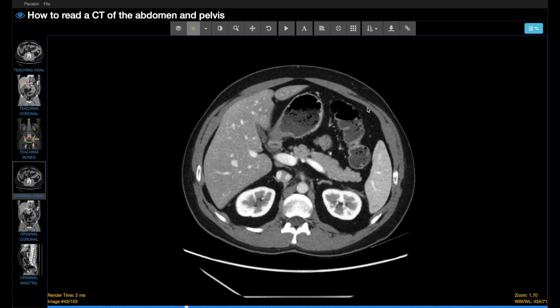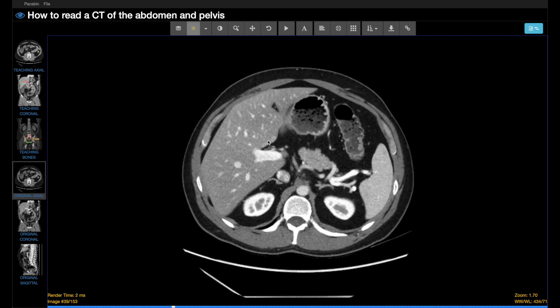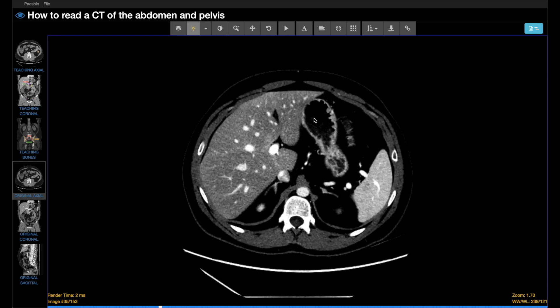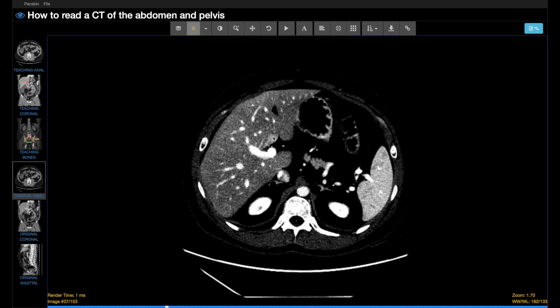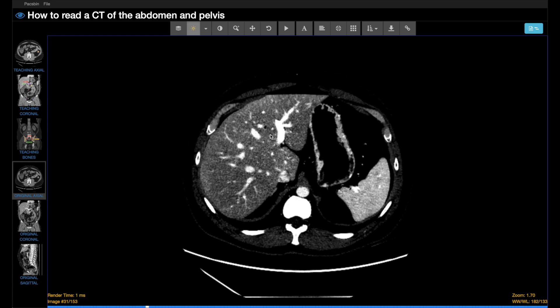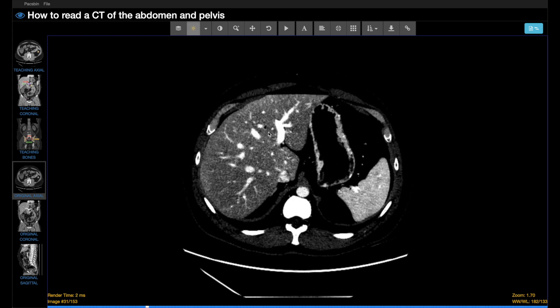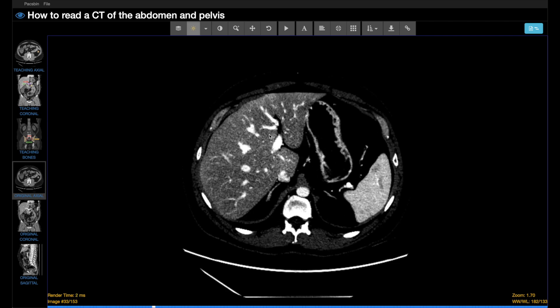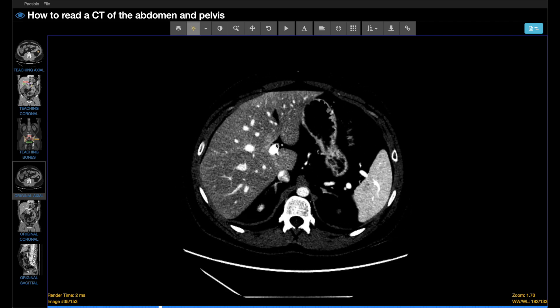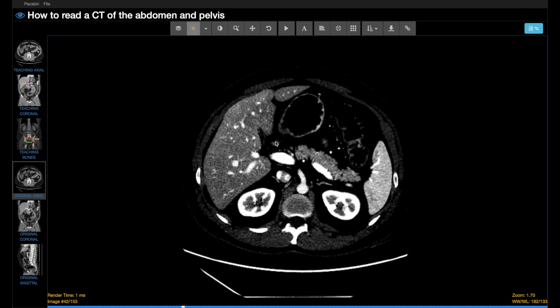This is a standard window that helps us to see the enhancement of the abdominal organs, and we can do some manual adjustments to do more of a liver window, which helps subtle areas of variable enhancement due to hepatic steatosis and sparing, or subtle small lesions. The small cyst will really stick out a lot more using the narrow liver window.